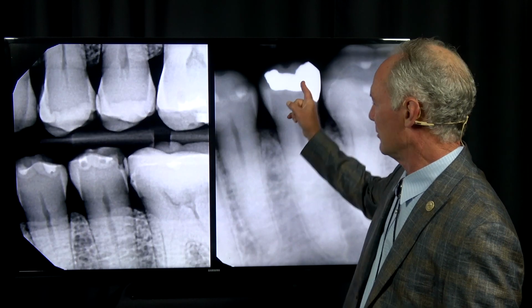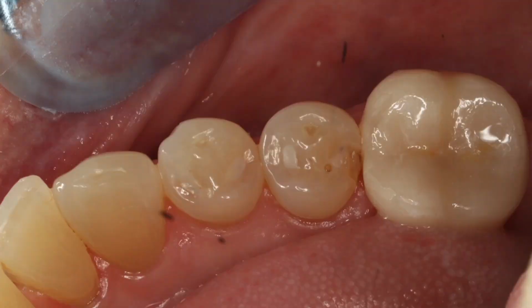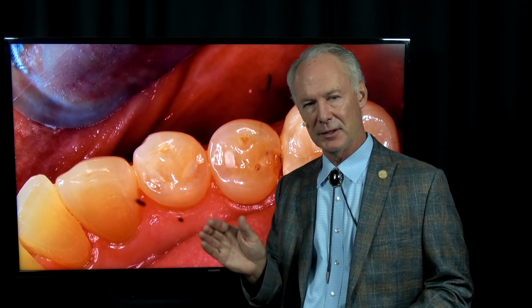So in this case, I'm placing a gold inlay to replace an old composite restoration. See, here's the composite. Now, I don't do class 2 composites. Why not? It's very difficult for me to get a completely sealed gingival margin, and it's very difficult to get a really good contact. Plus, the coefficient of thermal expansion when you have a large volume of composite is not good. The coefficient of thermal expansion of composite is about 75.